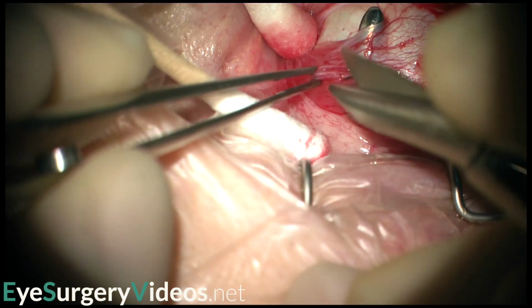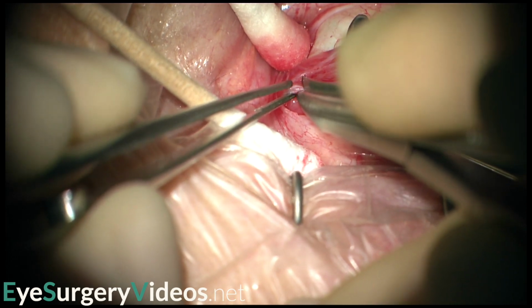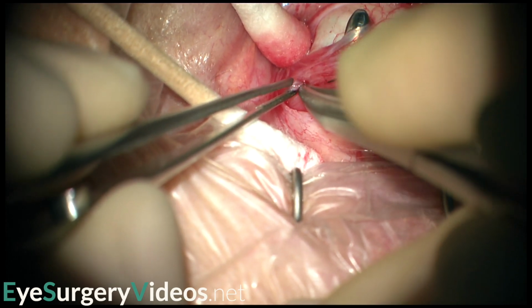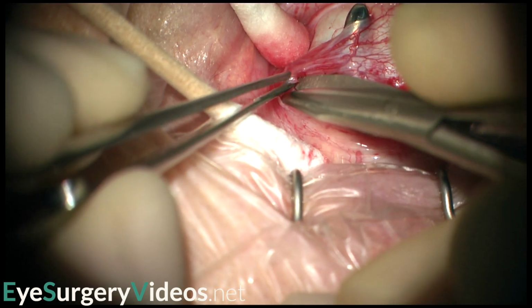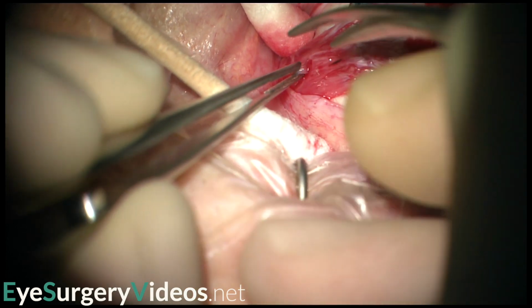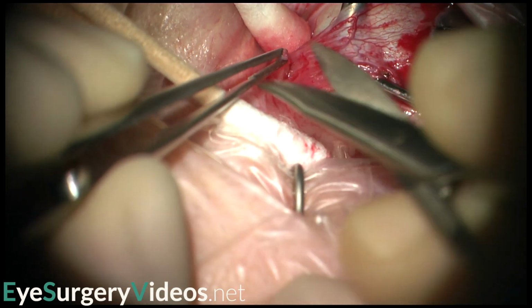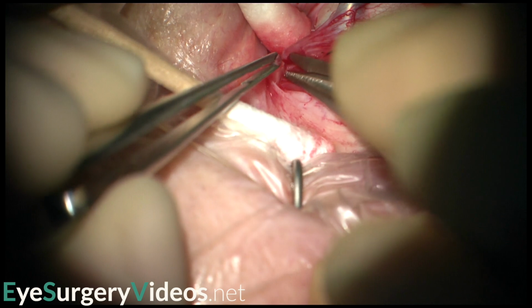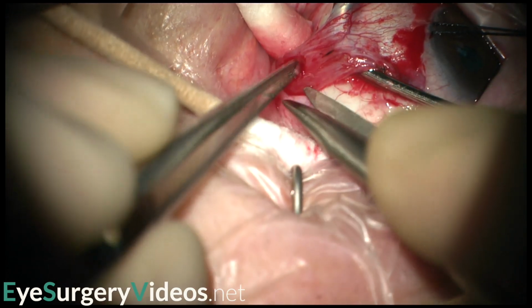Once optimal muscle exposure has been achieved, a biopsy can be taken in the plane parallel to the fibers, as this may confer reduced risk of restrictive strabismus and muscle rupture, as well as providing longitudinal fibers for histopathological assessment. Minimal handling of the biopsy is probably advisable to reduce crush artifact and improve histopathological interpretation.